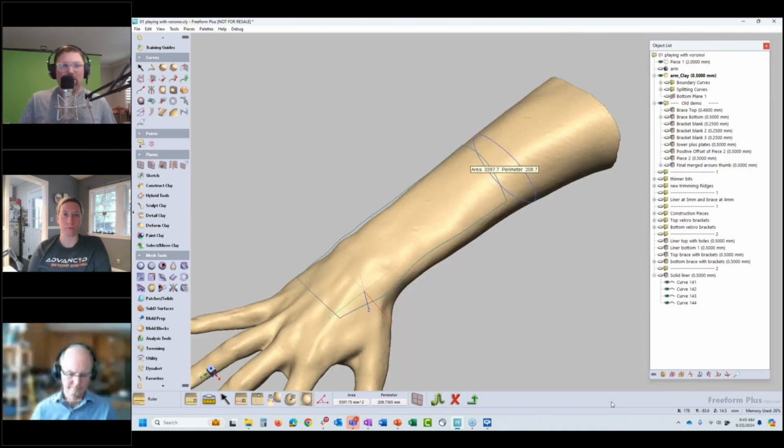We want to be really good at creating the devices on out, and we want to encourage people to measure what they do. And I think that's where Freeform really can come into play, is you can truly measure what you do. Yeah, that's an important point.